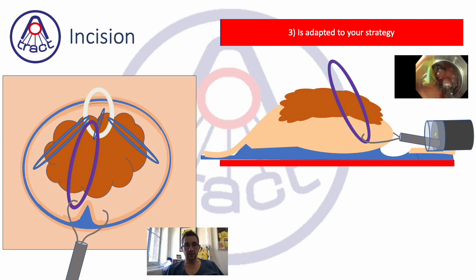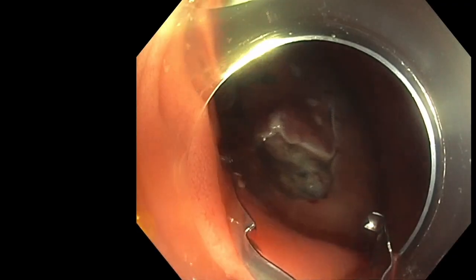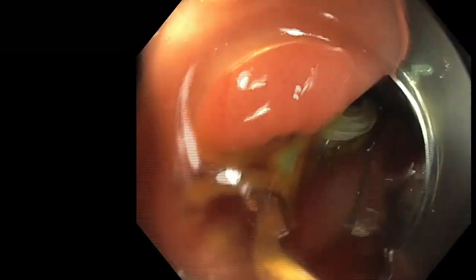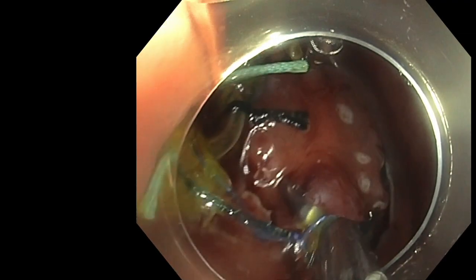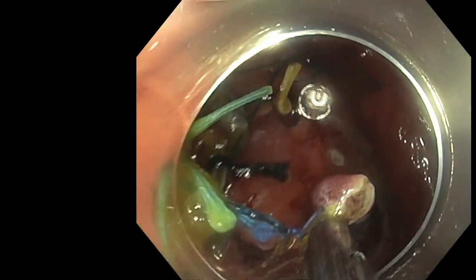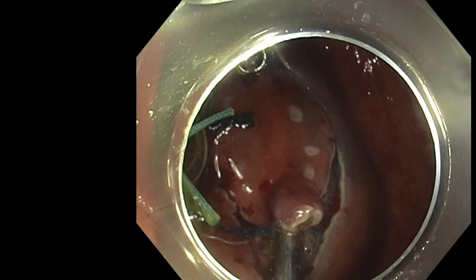Last point: your incision should have a relatively large margin. If you want to use a traction strategy and you have a small margin, it is very difficult to catch the edge of the lesion without damaging it. Taking more margin is not losing time — it saves time. Here we use the Attract device to do traction, but if you have done a very small margin it's very difficult to catch healthy tissue at the edge without damaging the lesion. So take large margins: you will save time, not lose time, in the final steps.